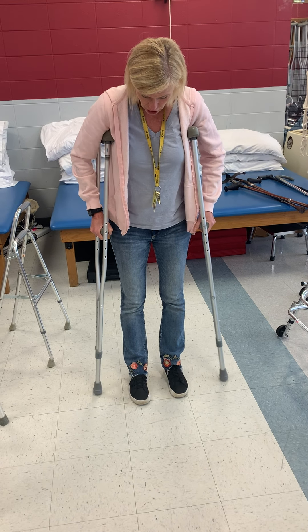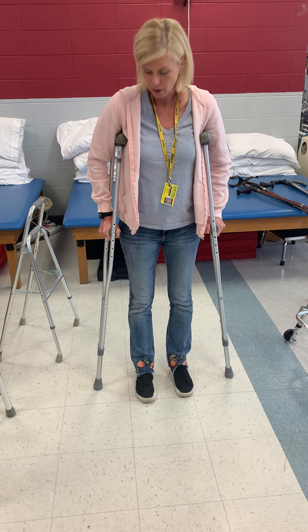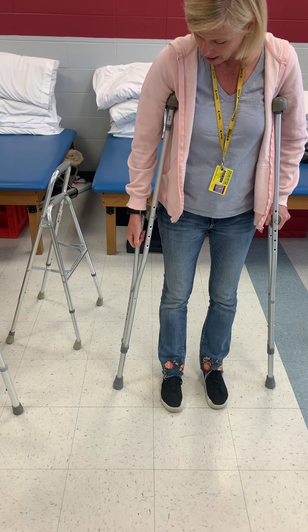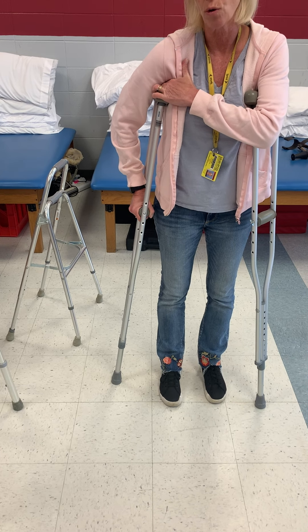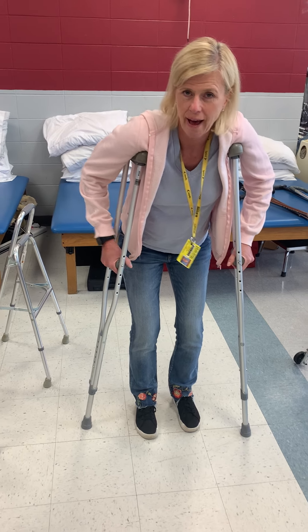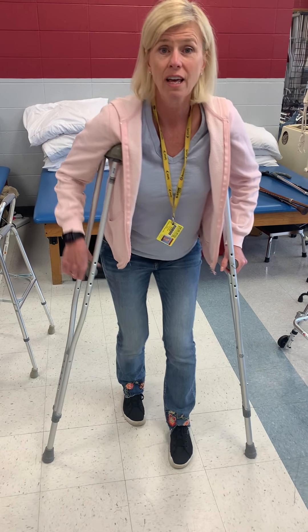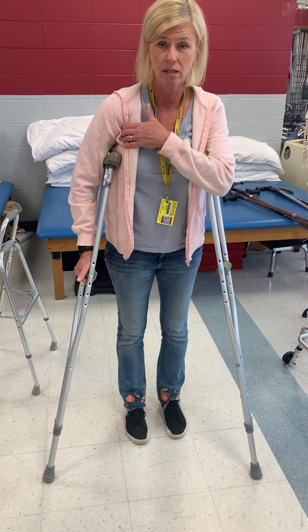When adjusting crutches, you want them placed about four to six inches out to the side of the foot. You want the elbow — once again — at about the ulnar styloid process with about 20 degrees of elbow flexion. There should be two finger widths of space underneath the axillary part of the crutches. People should never be leaning on crutches with their armpit — what's underneath that arm is your brachial plexus.